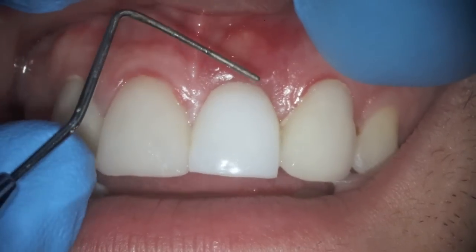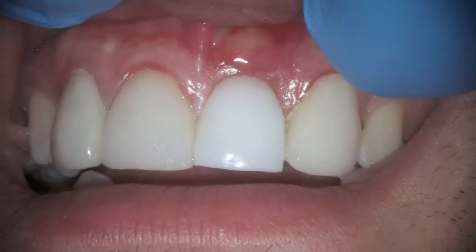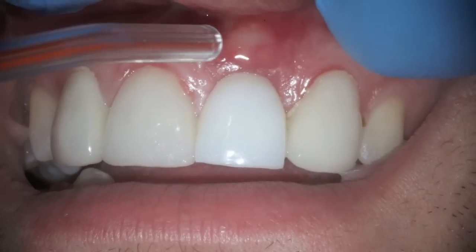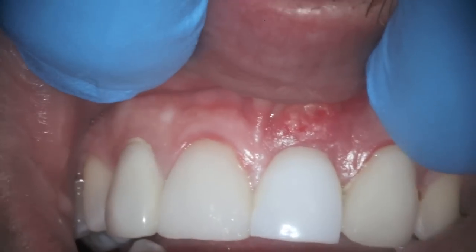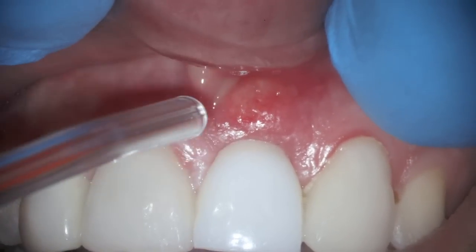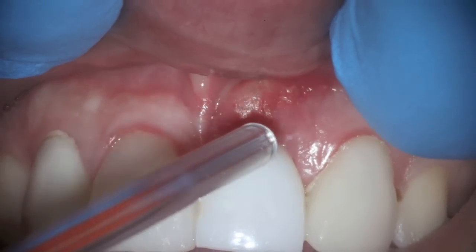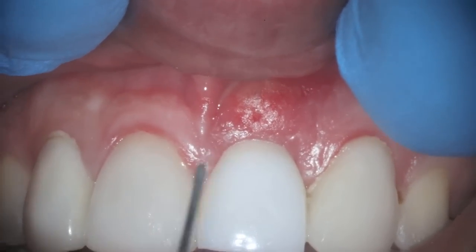Like I said, after we went ahead, cleaned everything up, actually took the implant out to explore if there was any infection or food particles or what the possible problem could be.